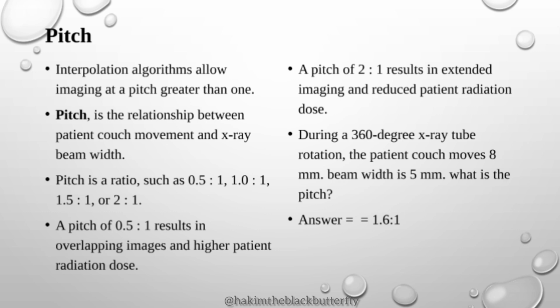A pitch in CT, in layman's terms, compares the rotation of the tube and the detector and the speed of movement of the patient's couch. Just like what we have been looking at, the tube and detector are moving continuously around the patient, and the patient is on the table also making a motion through the bore.